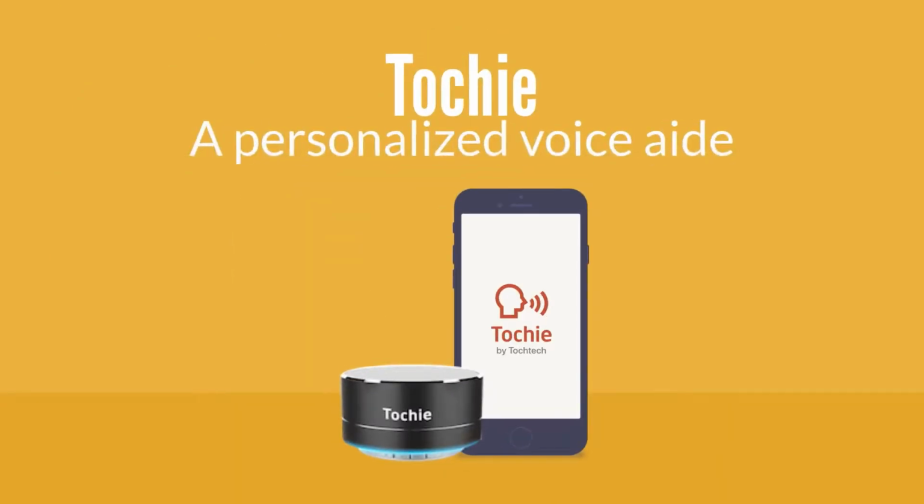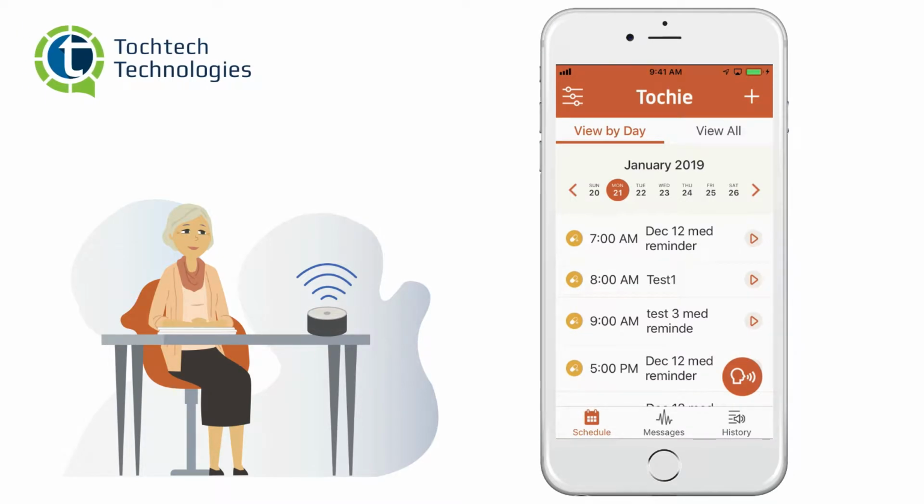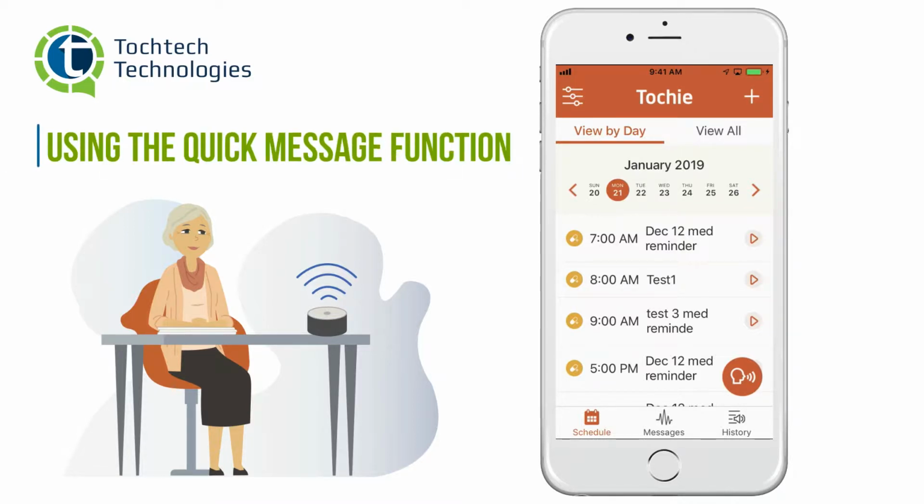Welcome to a quick guide on using Tochie, your personal voice aid. This video assumes you have been successful in setting up your Tochie device and have it connected to Wi-Fi. In this video, I will show you how to use the quick message function.